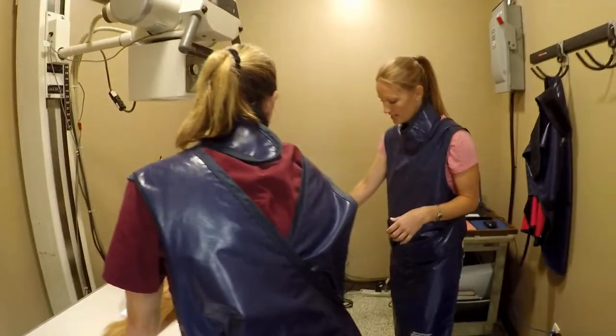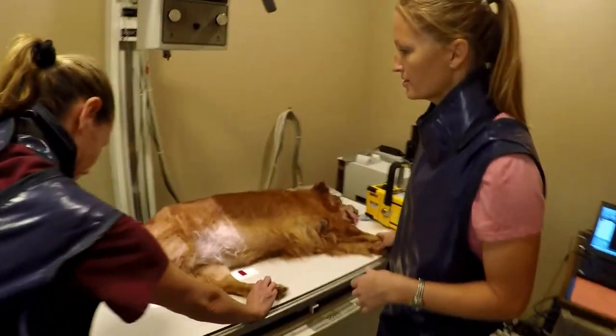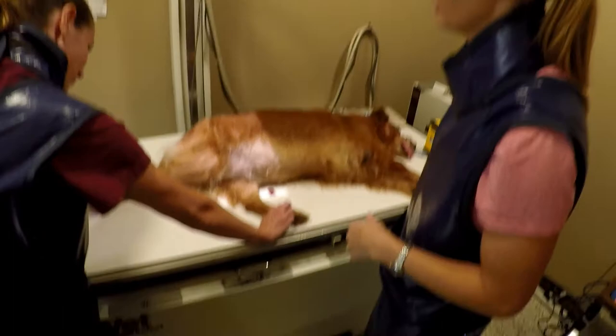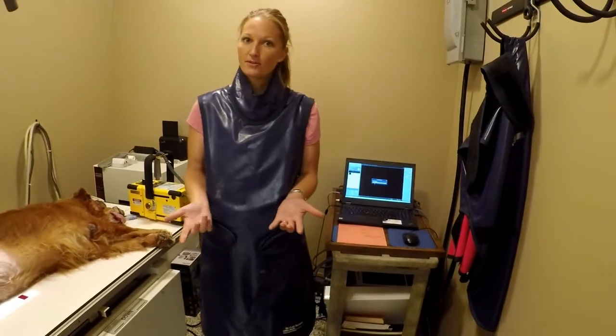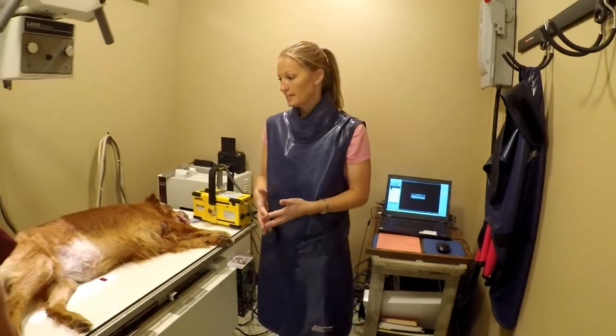We've already got it set up on our machine here. To get some hip x-rays, we'll just push this button here — quick snap — and that's got it. We'll take a couple of views so we can see the extent of the damage.